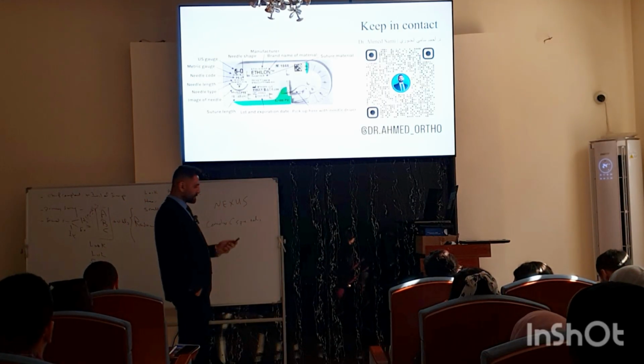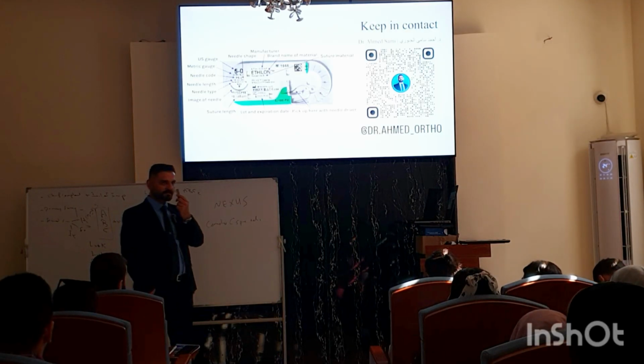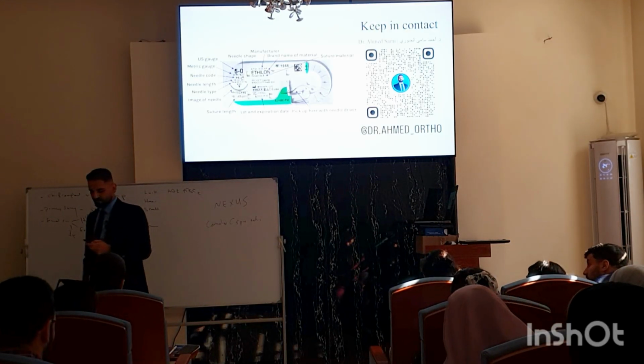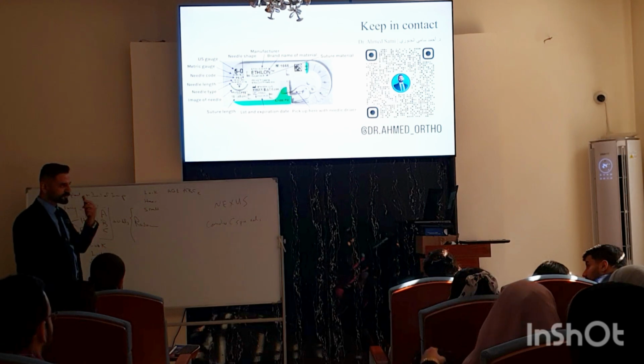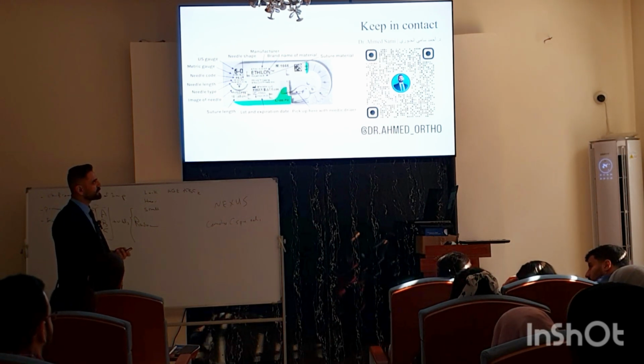Maybe in the emergency room, if it is facial trauma, or especially around the eye, the eyelid, the ENT and the ophthalmologist and the plastic or the maxillofacial surgeons, they are using these threads.